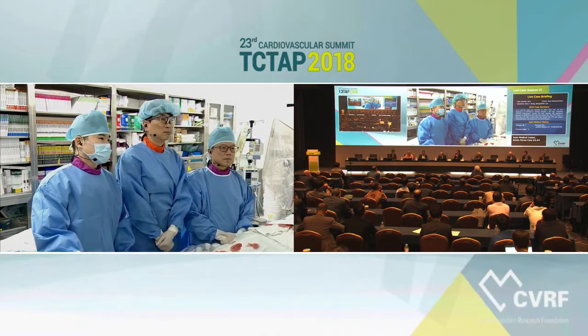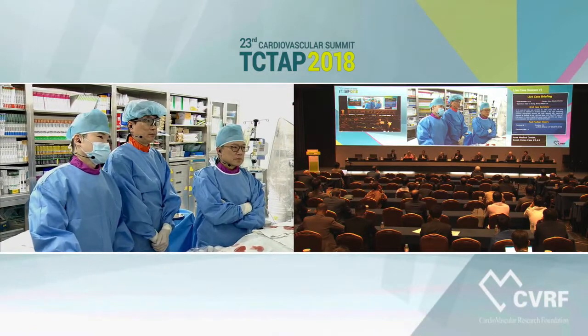The question in these calcified lesions is twofold. One is the extent of calcium: is it circumferential, yes or no? And the second question is always, is calcium protruding into the lumen, which typically makes the balloon rupture? I think both questions can be nicely answered with invasive imaging. The advantage of OCT in these lesions is that we can also assess the thickness of the calcium, which gives us an indication of how much lesion preparation we might need to modify and extend the plaque. In this situation where the ostium needs to be assessed, obviously OCT is not very suited. I agree on that. Okay.